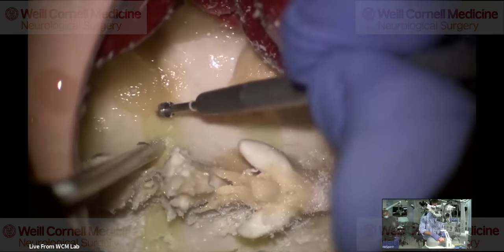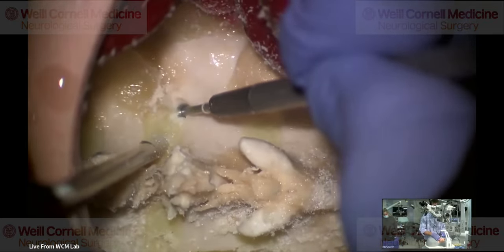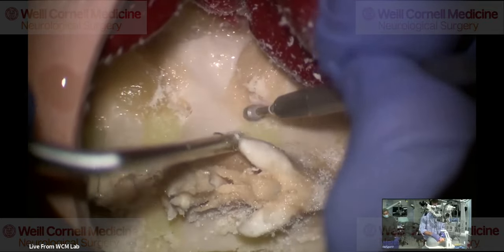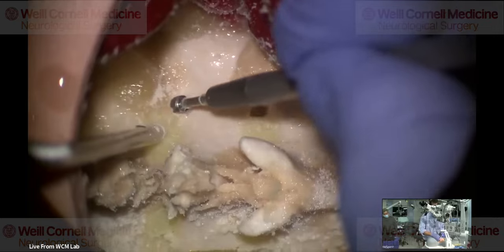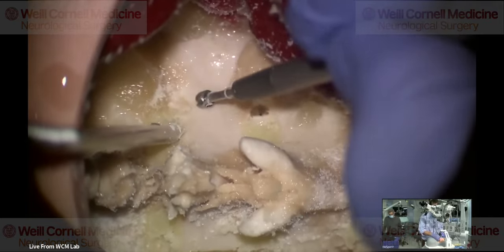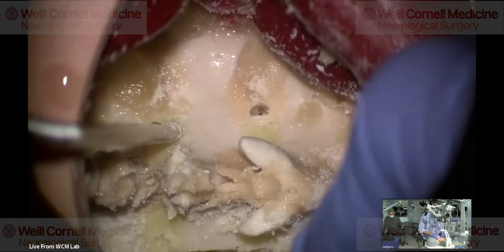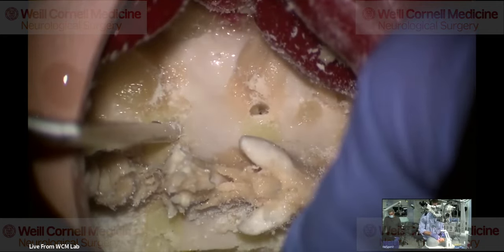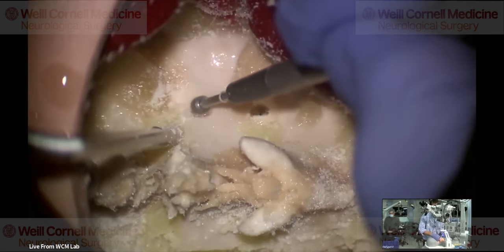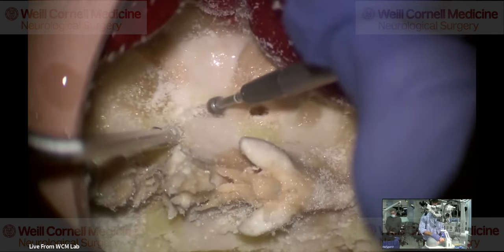On the other side, what I do is I notch the top and the bottom, because it's like an airplane wing. This is all cortical bone. This is all cortical bone. So you've got to get through that cortical part. And then I've done this part, so I know how thick that lamina is. So I'm going to go for about 50% of that. And so I'm going to go zip, zip, zip, zip, zip.